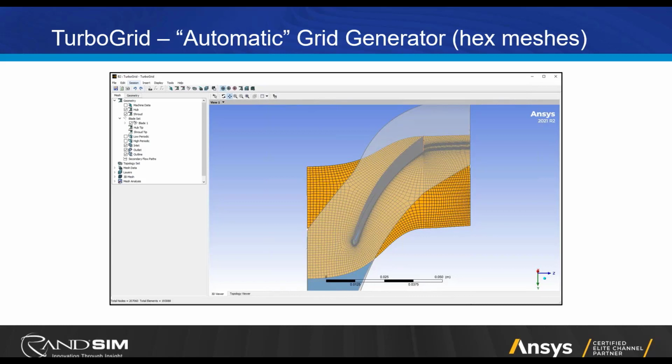All the topology generation is done behind the scenes. You don't see anything. It's very well defaulted. In fact, most of the time when I use it, I don't have to hit anything. I just take all the defaults and I get this nice mesh automatically. You can see it clusters nodes toward the surface of the blade to capture the boundary layer, and then it's more coarse away from the blade. But again, this is generally done automatically. The user has almost no involvement in this step. Occasionally you might have some grid issues that you may have to go back in BladeGen and tweak the geometry a little bit, but by and large, it just works automatically the first time. It's really an excellent tool.